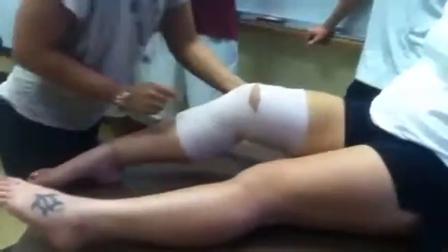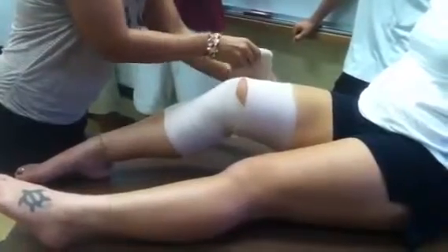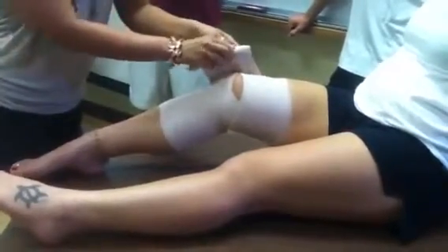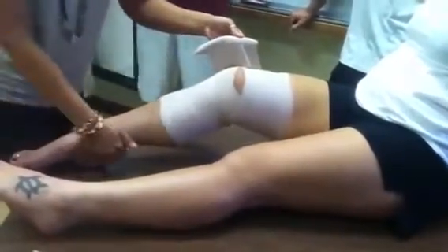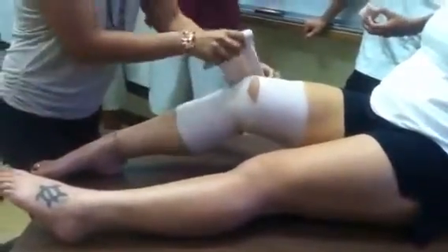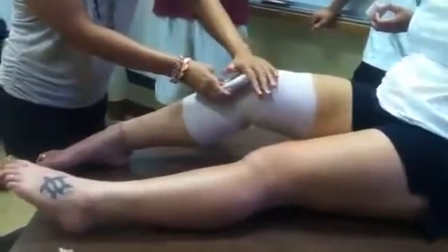Also, why is there space in between? Because for this example, it's not a complete grade 3 sprain in the knee, so we can have a little bit of space there — just like sometimes we can have a space on the heel. But if it was a grade 3, more severe, I would have you guys close it, because that is an area that can swell up.